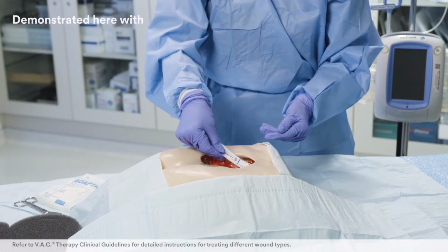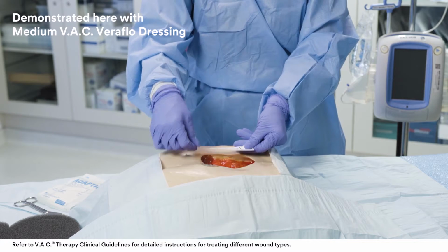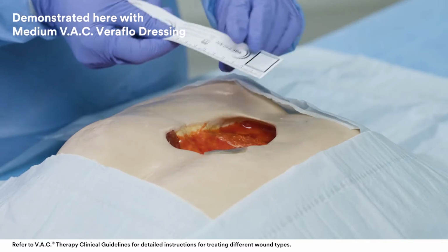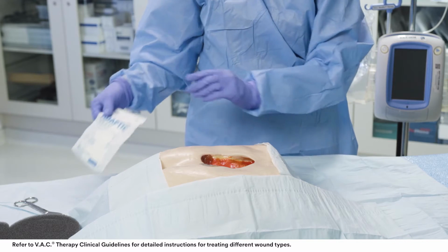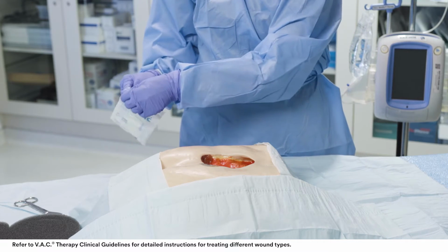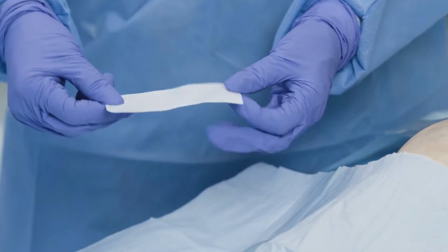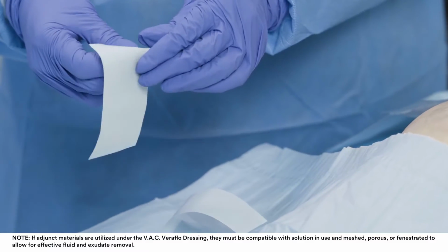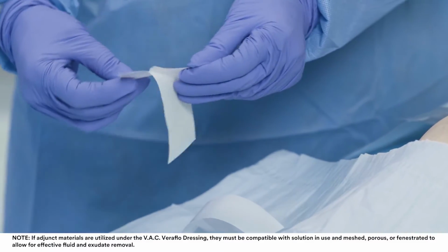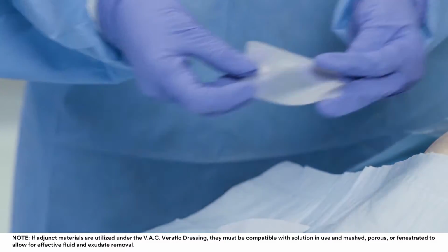Assess the wound's dimensions and pathology, including the presence of undermining or tunnels. Do not place any foam dressing into blind or unexplored tunnels. A non-adherent material can be used prior to foam dressing placement in order to protect delicate structures, such as blood vessels, or to facilitate future dressing removal. Protect fragile or friable peri-wound skin with medical-grade transparent film, skin protectant, or hydrocolloid.